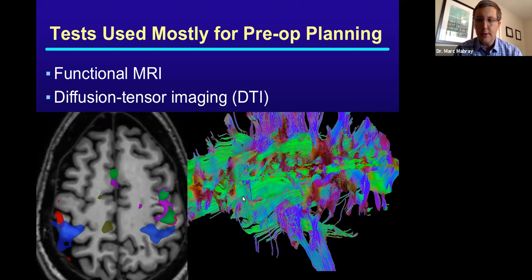And the idea is to localize areas of functional activity in the brain.